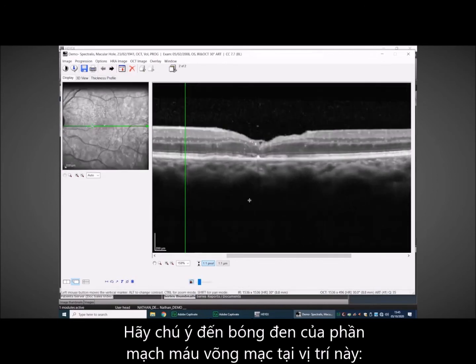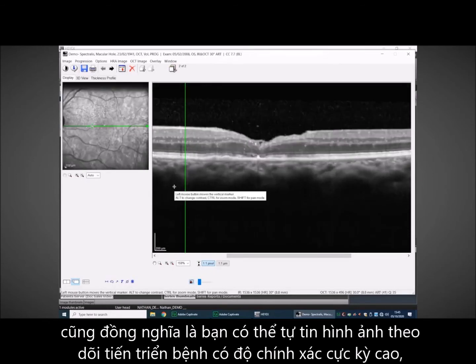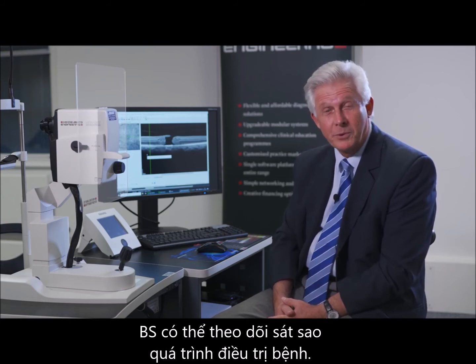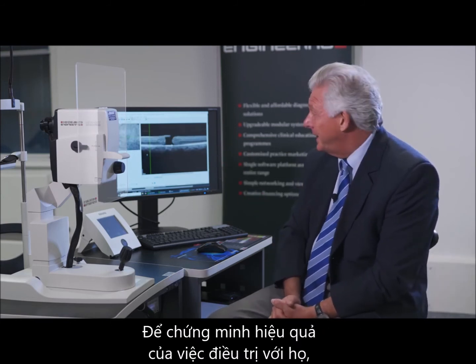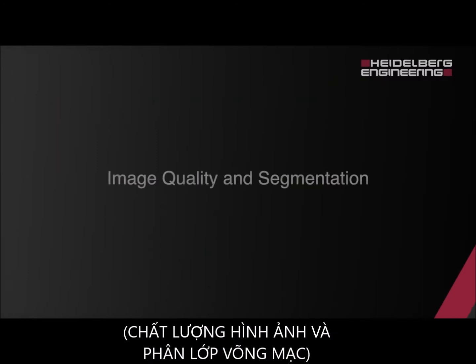And if you notice here, this shadow from this vessel between the baseline and the follow-up, it doesn't move, and so you can be confident that those scans are very accurate, and you can track a follow-up scan very well. Not only that, in this case you can show your patient how nicely that procedure went, and maybe the reason why their vision came back.